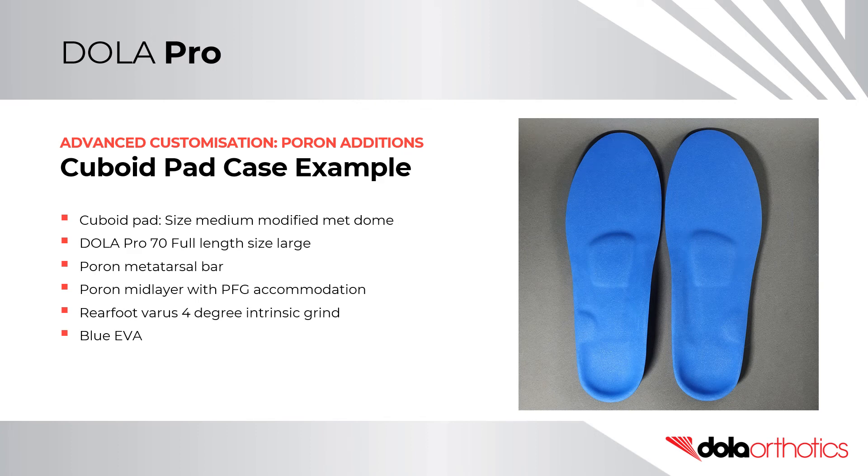In this case example, a medium Poron metatarsal dome was modified for a cuboid pad and was placed on a size large DollarPro 70 soft density full length orthotic shell. The prescription also included a Poron full length mid-layer with a plantar fascial groove accommodation, a rearfoot varus intrinsic grind, and a Poron metatarsal bar placed in a pre-metatarsal position. This prescription was completed with a blue EVA top cover and is a great example of how a prefabricated orthotic can have multiple prescription variables applied in clinic.